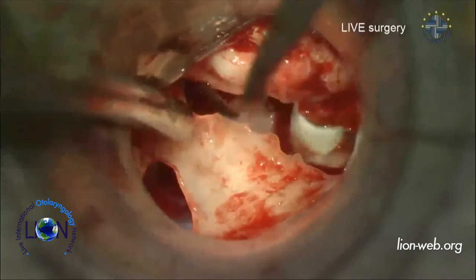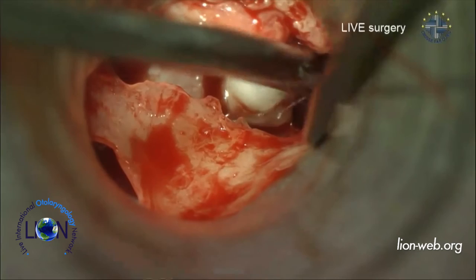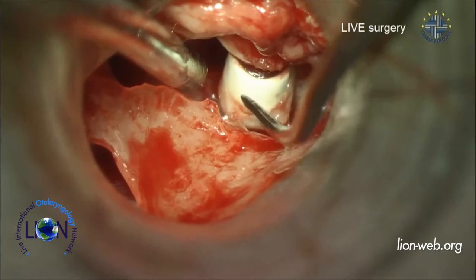Yes. And that's interesting because it is exactly the problem that we had with this type of prosthesis. According to the same thing as the video that I show you, everything seems fine. We have quite a nice position of the prosthesis. And there's a tilting. You see how it moves like this. Left, right. I don't know if you can see this lateral movement?